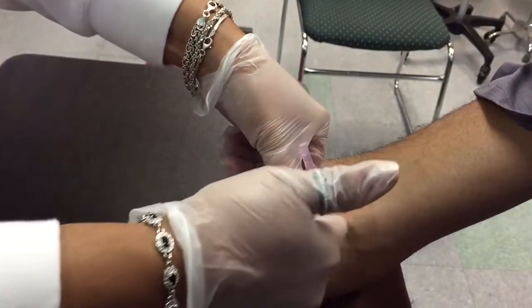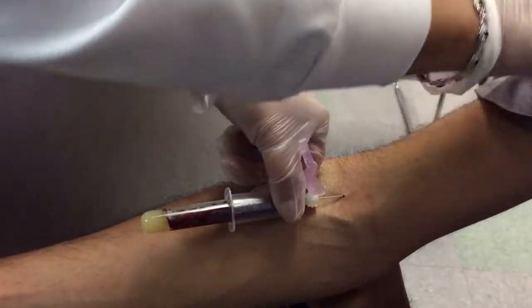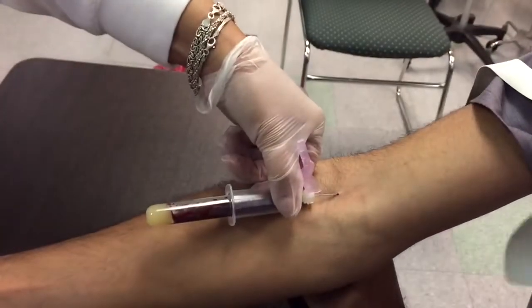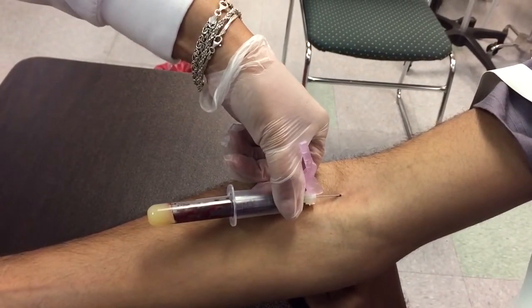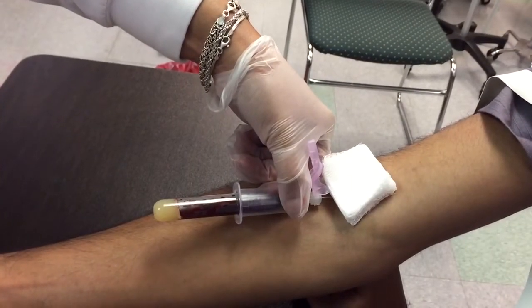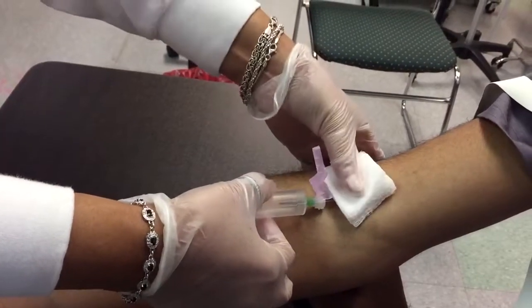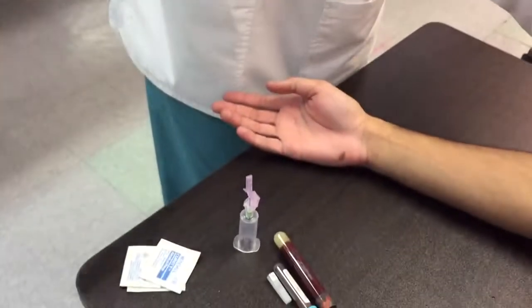Insert the next tube, making sure that needle does not move. Now it's filling up — pop your tourniquet, tell your patient to relax. Remove the tube, do not press the plunger, and put your safety cap on. There you go — the proper way of drawing blood from the diva herself, Miss Kim Lewis. Thank you very much, enjoy your day.